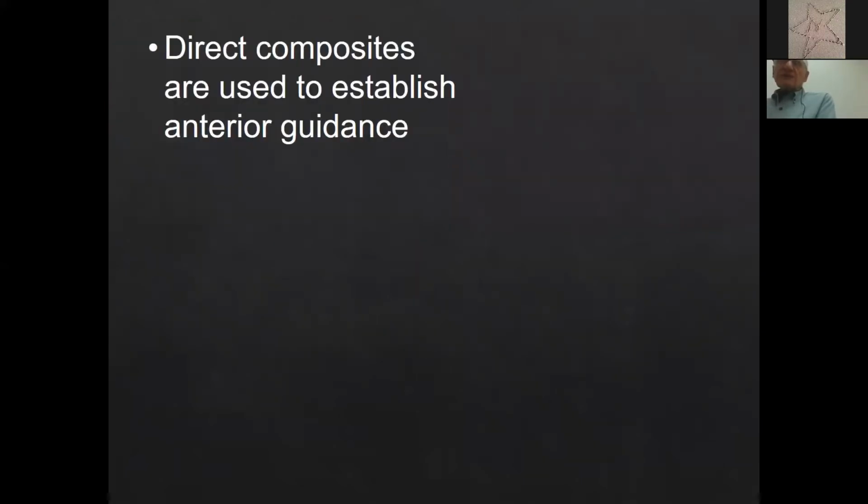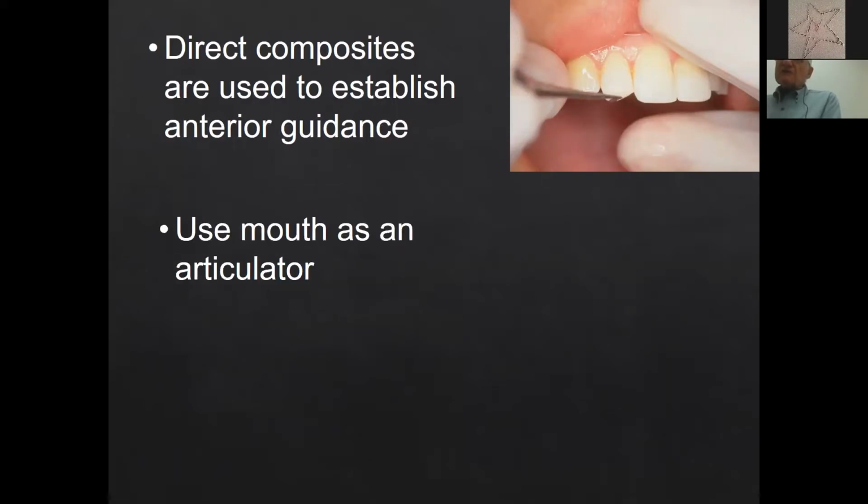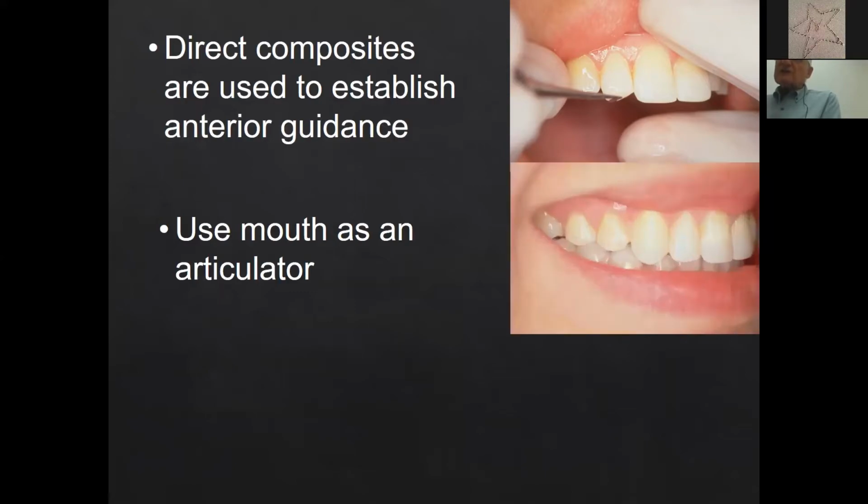Now we can turn our attention to the anterior teeth. And it was decided to use direct composites so that we didn't have to, if we used porcelain veneers, we would have to remove tooth structure. But with direct composite veneers, all that we're doing is adding to the tooth and not removing anything from it. And we decided to do this directly in the mouth and use the mouth as an articulator to establish our anterior guidance and canine function.